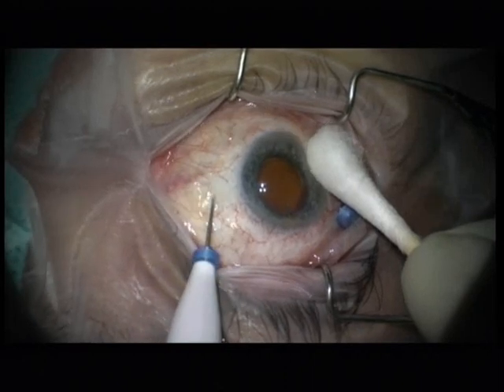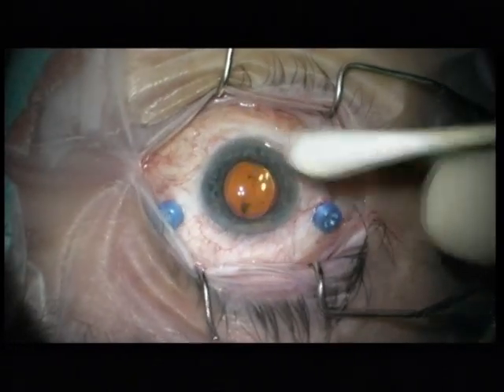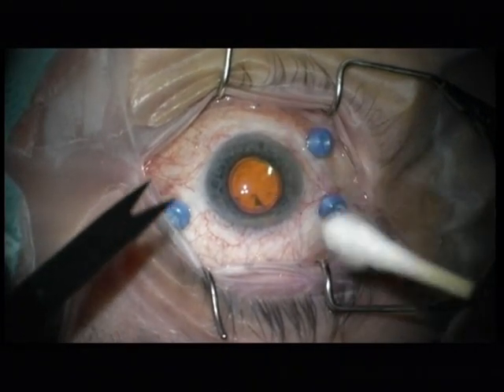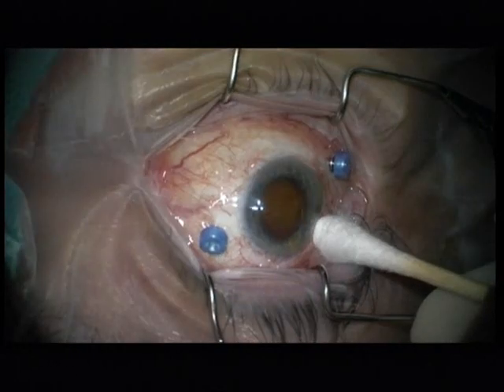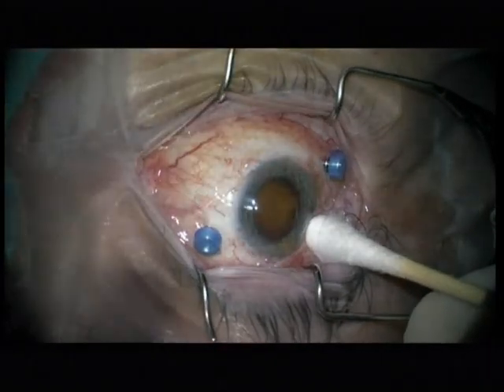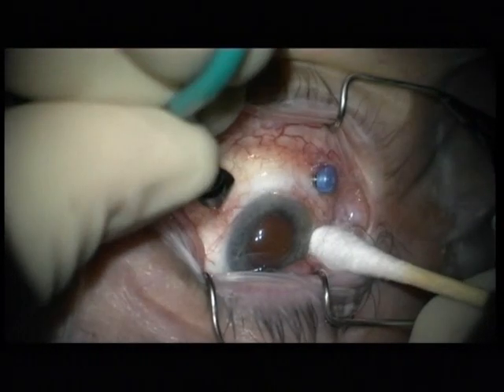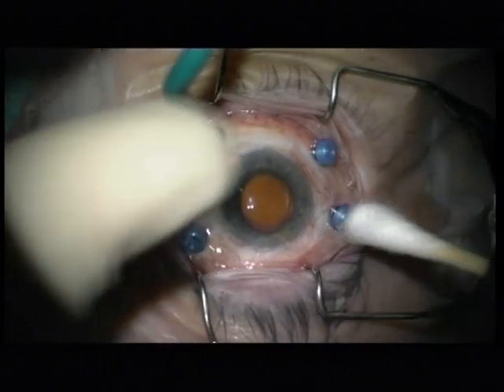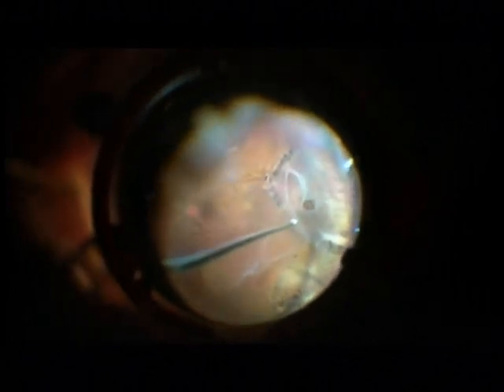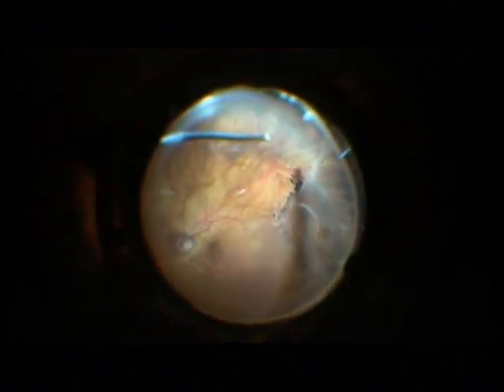I would like to present a retinal detachment surgery with 27 gauge. This is a very long eye with minus 12 diopters. I prefer 27 gauge for high myopic patients because the globe is very tight postoperatively and you have less gas tamponade leakage, which results in a very good tamponade postoperatively.